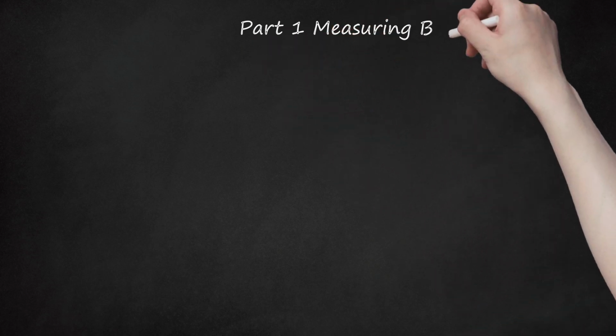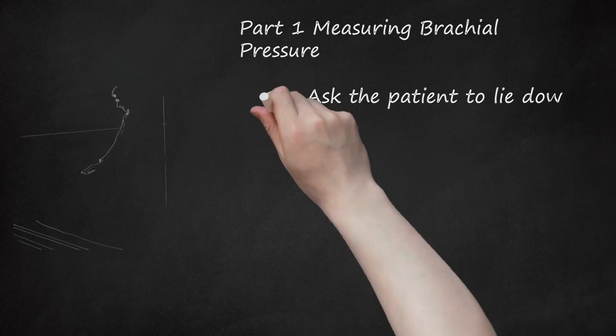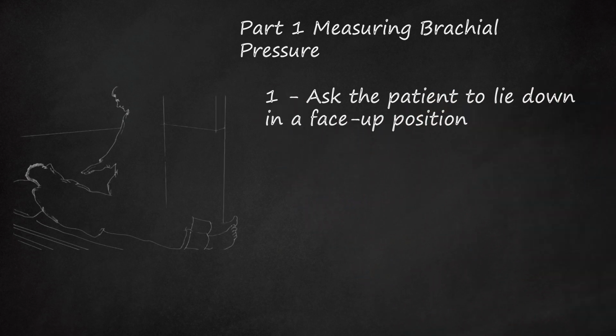Part 1: Measuring brachial pressure. 1. Ask the patient to lie down in a face-up position. Lying face-up is known as being in the supine position. Make sure that your patient is lying on a flat surface so that his arms and legs are at heart level. Give the patient at least 10 minutes of rest before taking his blood pressure.